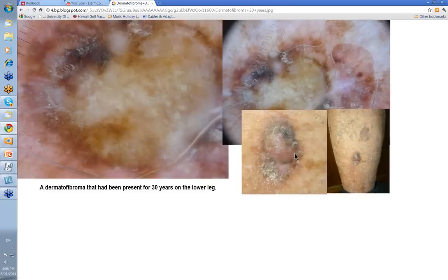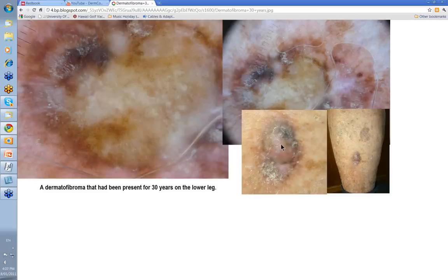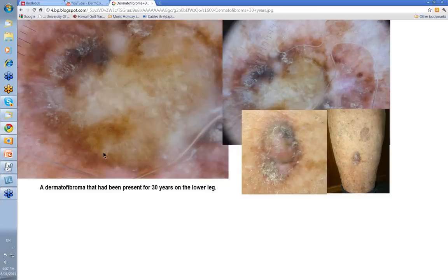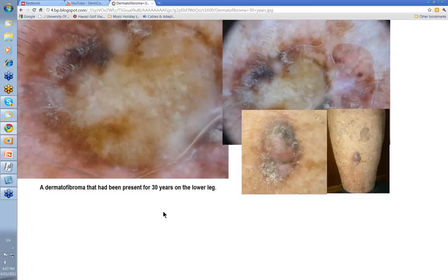Lastly, we'll end with this lesion here — clinically in this man's leg, he said this had been here for nearly 30 years. You've got this dome-shaped area, a bit of sclerosis and some scale on the surface, these dark areas. When you look at it with the dermatoscope, you've still got this white central scarred area, a blue-gray structureless area here, and still some lines reticular around the outside. So it still has the basic elements of a dermatofibroma even when it's been around for 20-30 years. They sometimes say dermatofibromas shrink with time, but this one has continued to thicken up and reach this sort of size even after 30 years.